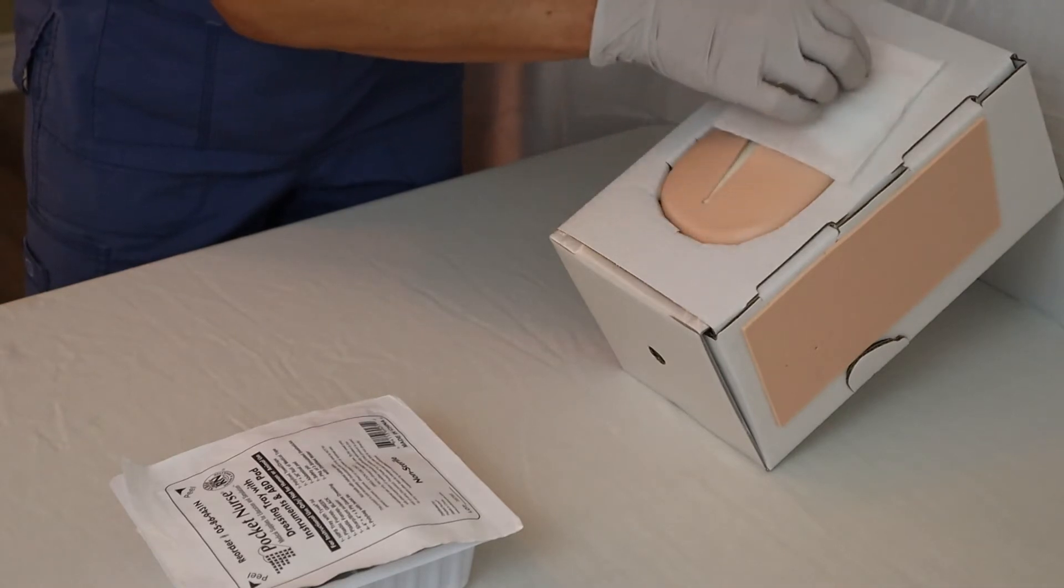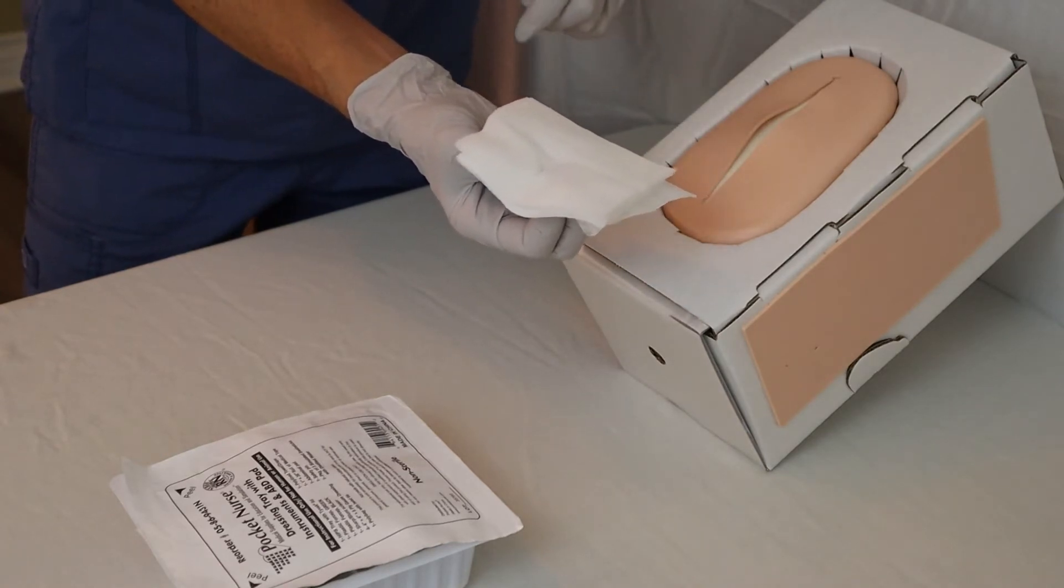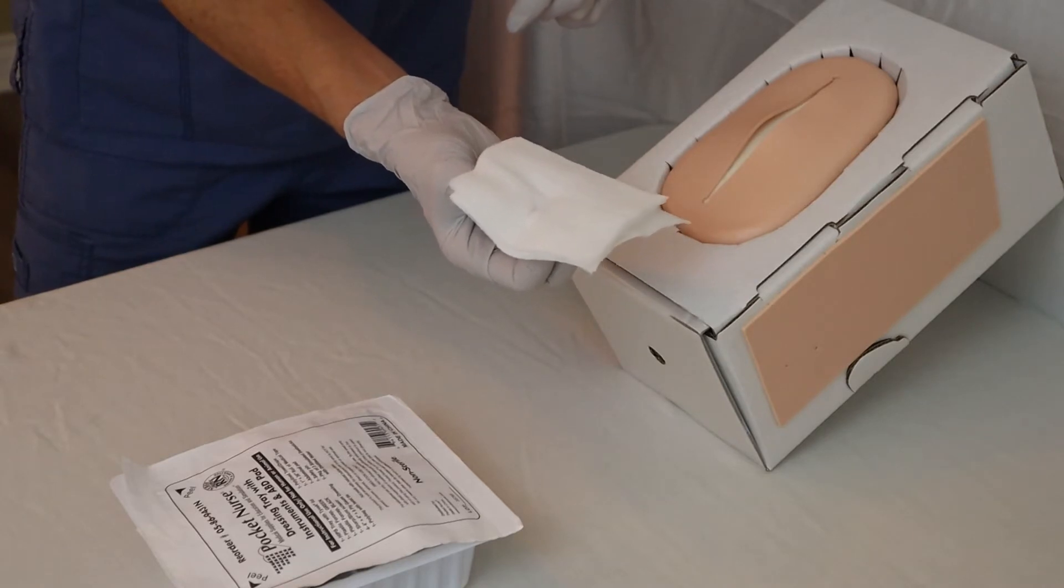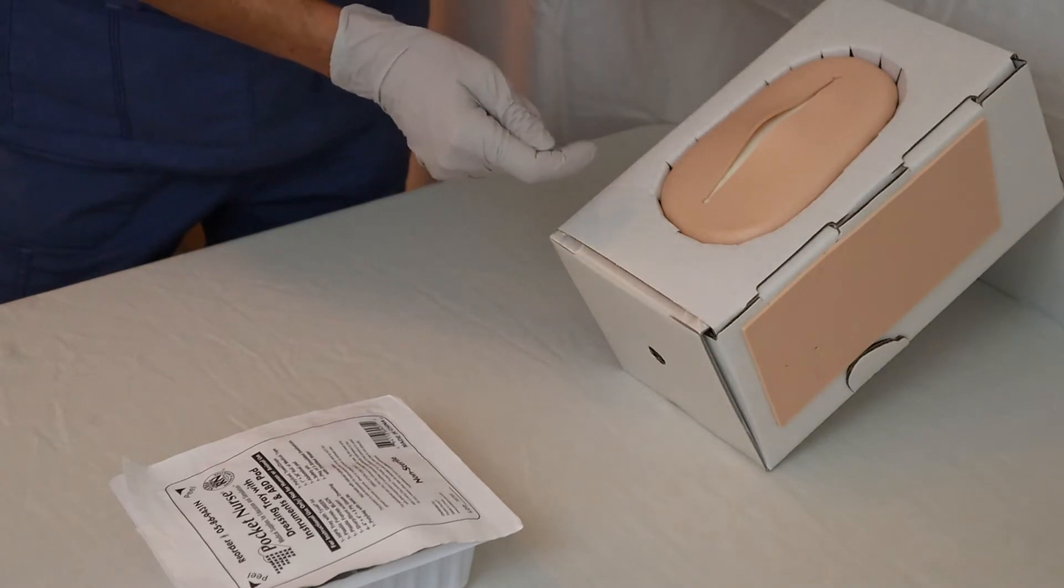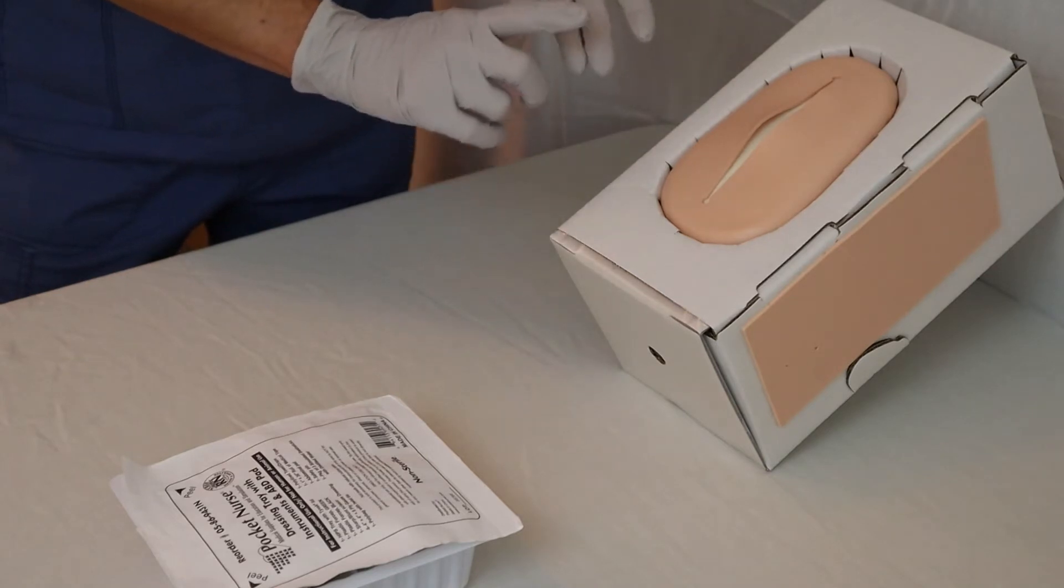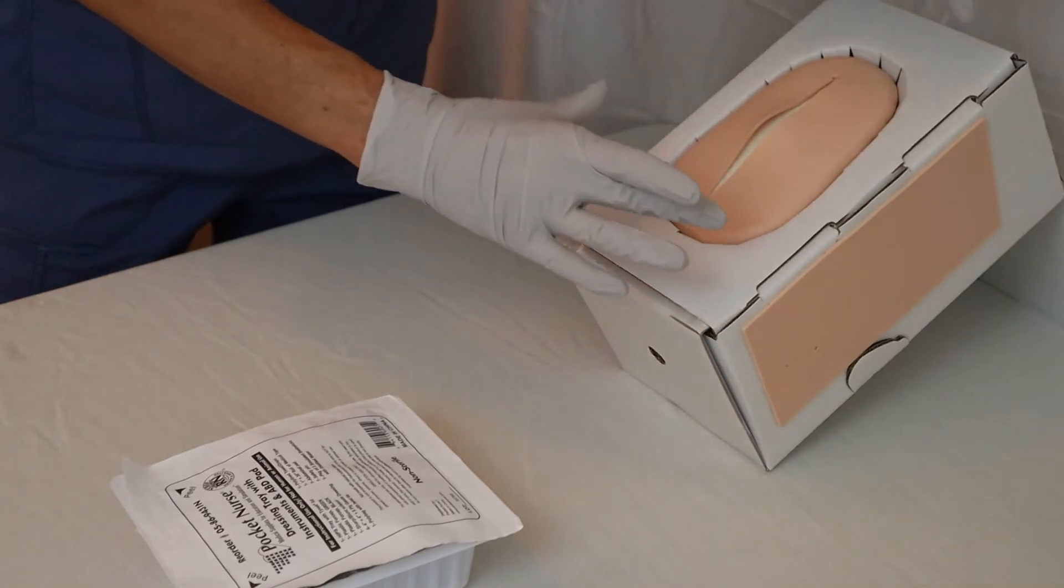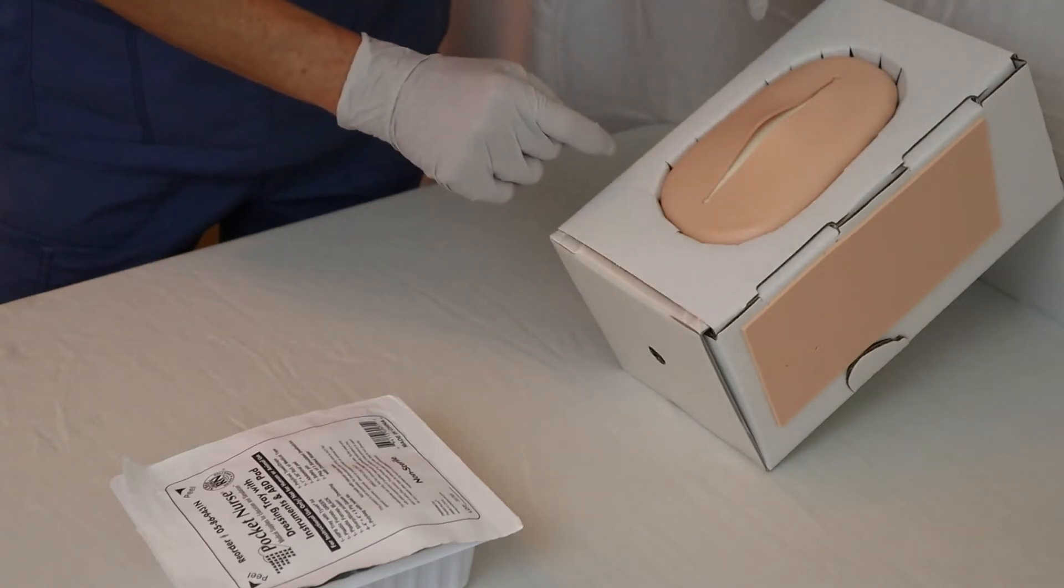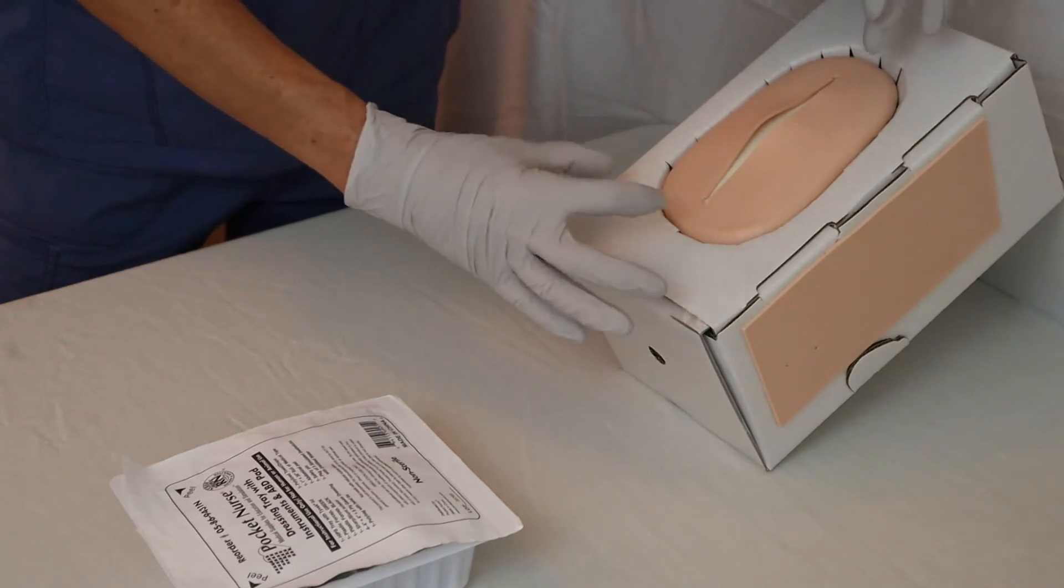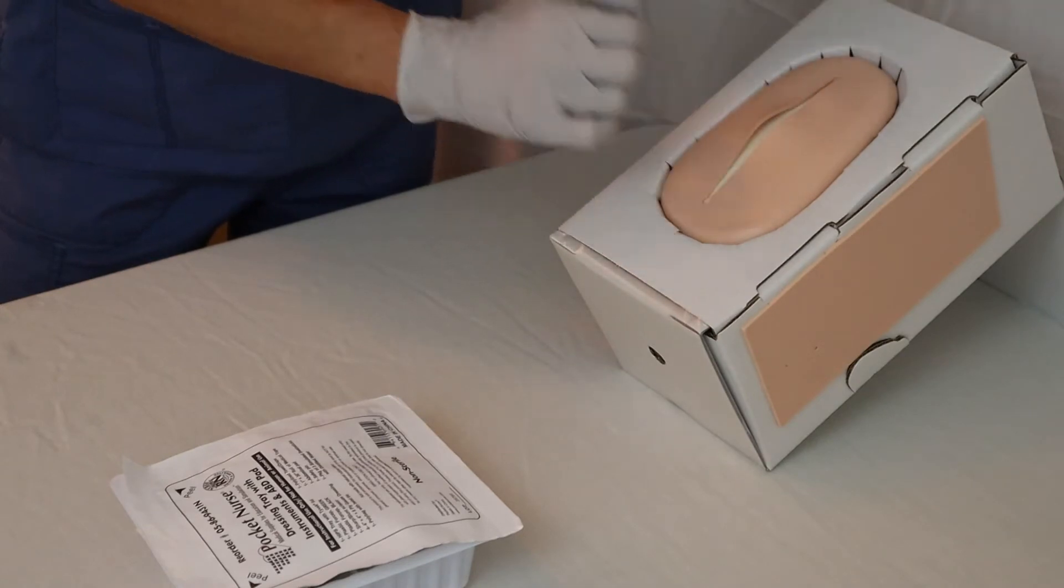Then I can remove the rest of the dressing. And this time, I will see if there's any discharge, draining, any kind of fluid that's on the dressing so I can put that in my charting later on. I also want to take a look at the wound. We use the acronym REEDA. So I want to assess for redness, ecchymosis, edema, as well as drainage and approximation. And the approximation means are the wound edges approximated, are they together? In the case of this wound, they are not really well approximated because I have this gap right here for this laceration. If they were approximated, this would be if there were, for example, sutures or staples in place and the two wound edges here were to come together.